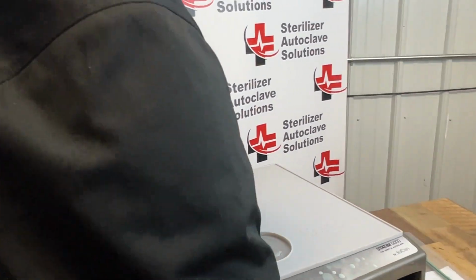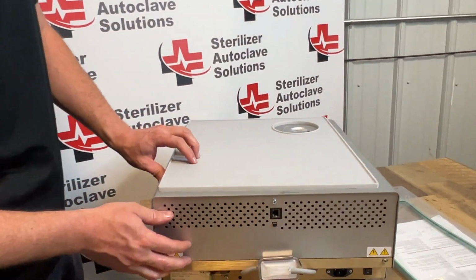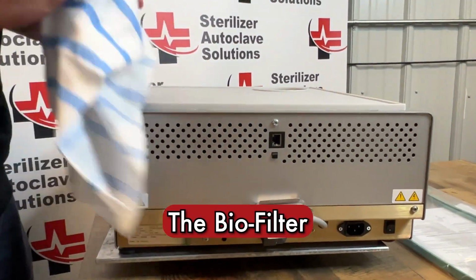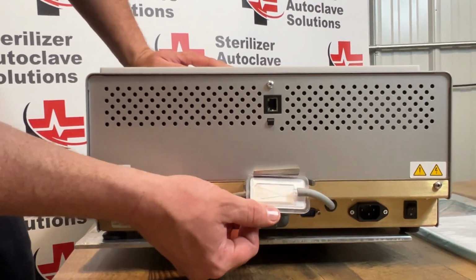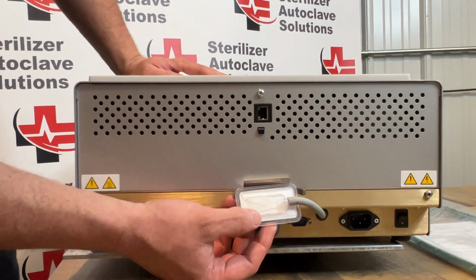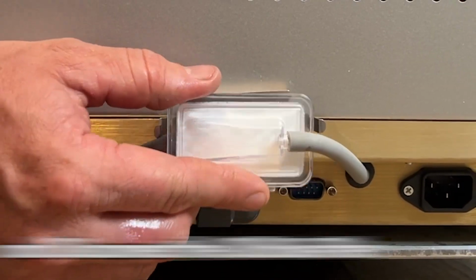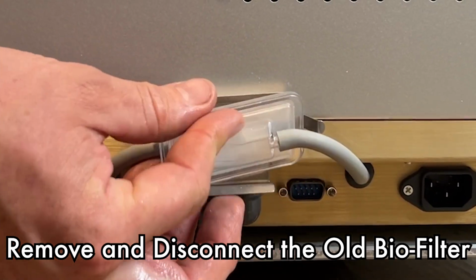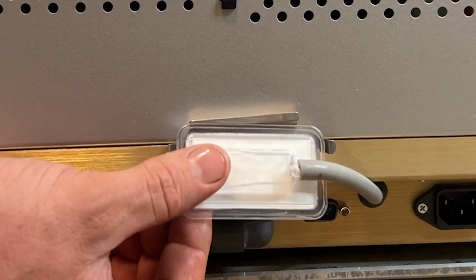Next thing we're going to move on to is our compressor filter and our biofilter. These are located on the back of the unit. If you look, there's an arrow on your biofilter. To remove this biofilter from the bracket, simply push down on that and it will pop out.